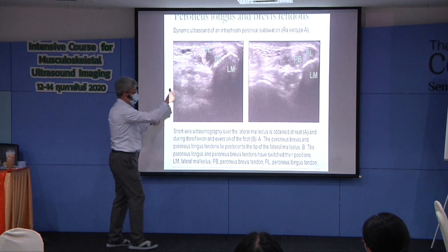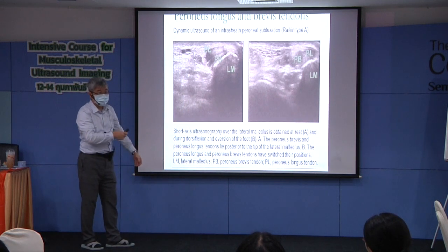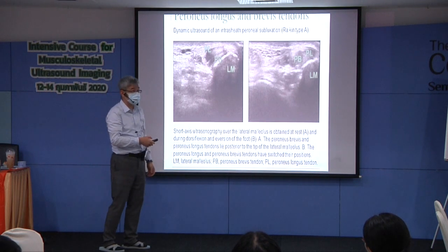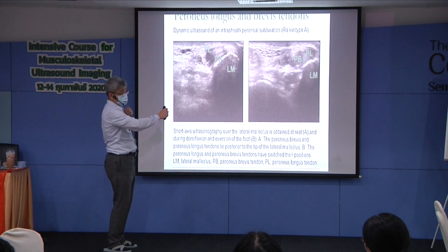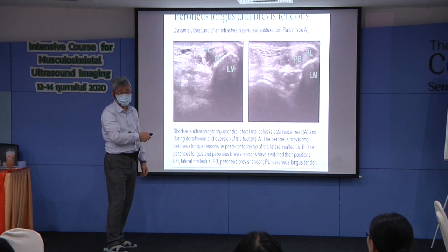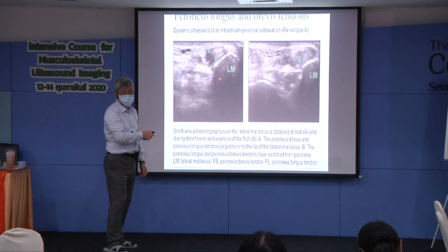So it's a clockwise rotation. Remember, in people with ankle instability, this clockwise movement may disappear or be different from normal.